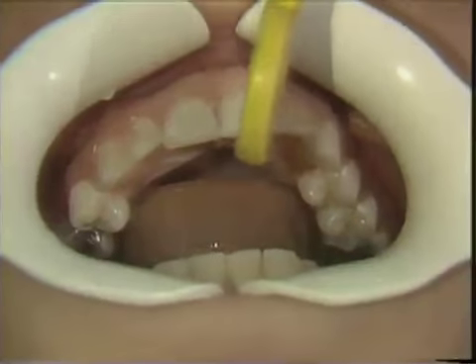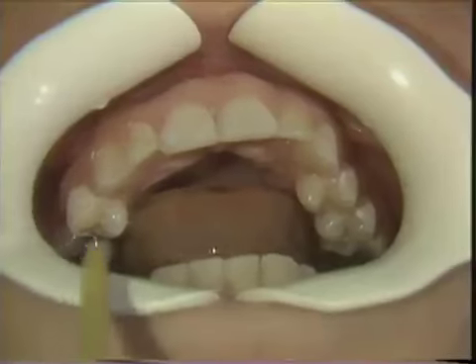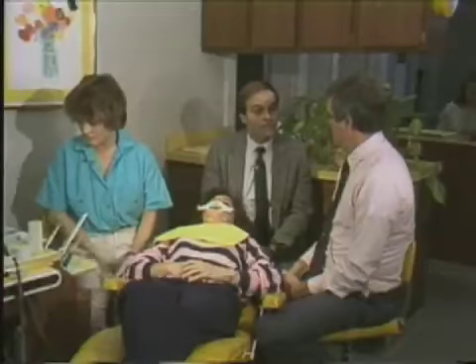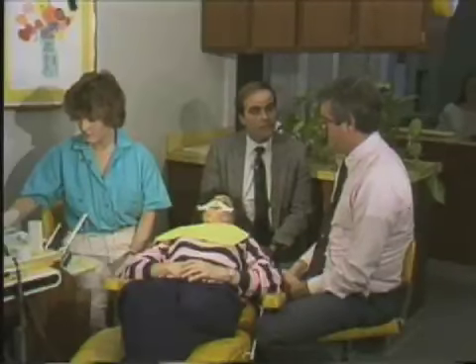From this point forward, isolation is critical. If saliva was to contact that enamel surface at this point, saliva of course contains protein and will remineralize that tooth. That tooth must be re-etched for 15 seconds at this point, and then rinsed and dried, and then proceed with the bonding procedure.